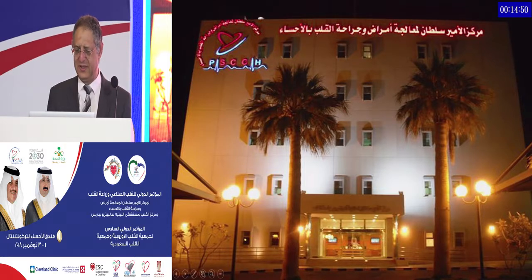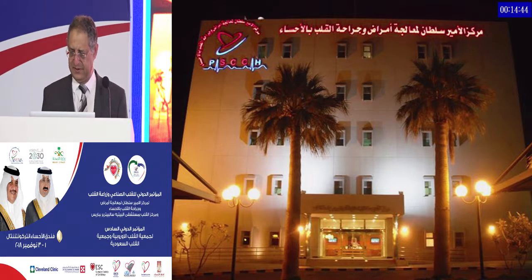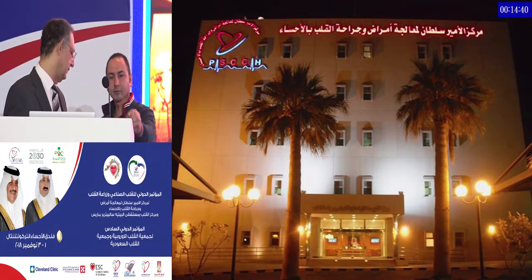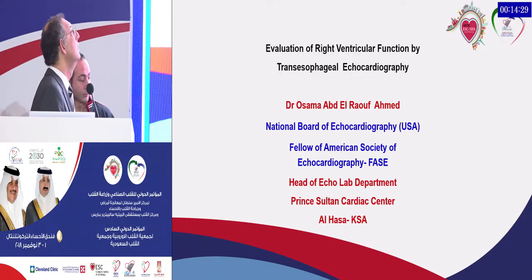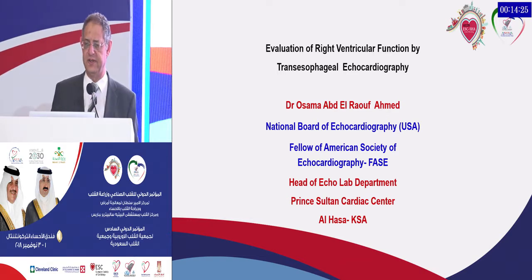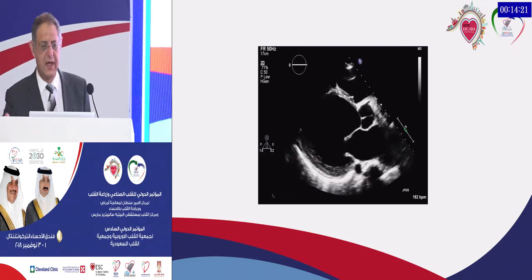My presentation today will be about the evaluation of the right ventricular function. Evaluation of the right ventricular function by transesophageal echocardiography.